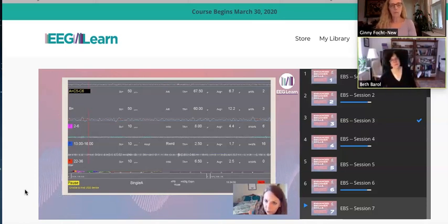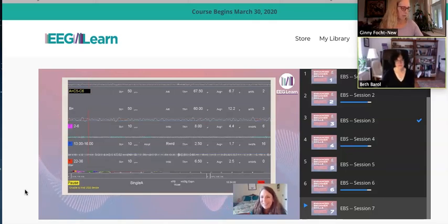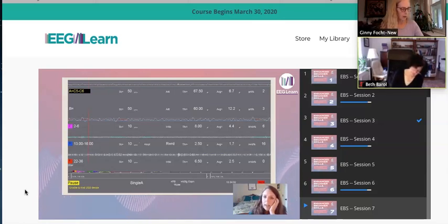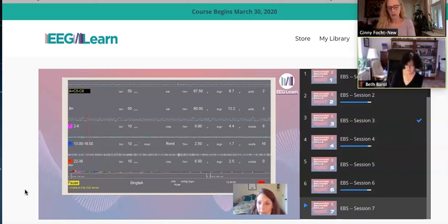Okay. Well, here, since everything has room to differentiate, and by the way, on an interhemispheric protocol, when all the numbers are way lower than you want them to be, that means one side of their brain is having more influence than it should over what they're both doing. And they need to differentiate a little bit more. Like we talked about how we want the left and the right side to both be activated, but we want the left side to be slightly more activated than the right? We need to have a little bit more difference there. So in this case, the target of my training is going to be increasing the difference in the reward band.